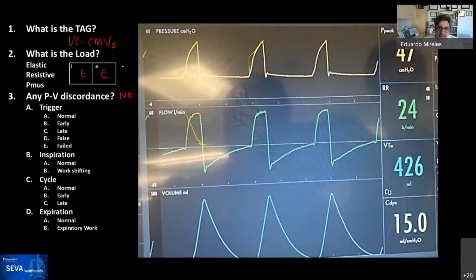Yes. In your experience, do you think there is any truth to the fact that, because I've discussed this with the respiratory therapists, in normal human beings, functional people, it's not an abrupt flow in and flow out. So a little bit of rise time or an exponential flow is more comfortable. Any comments about that for the patient?